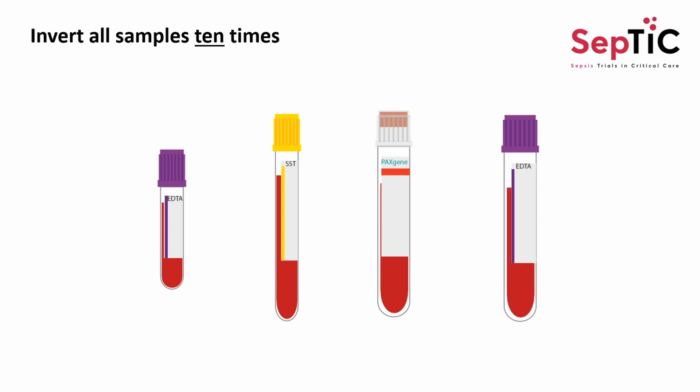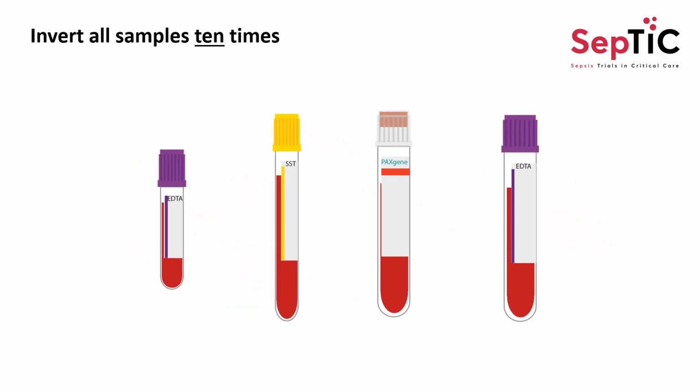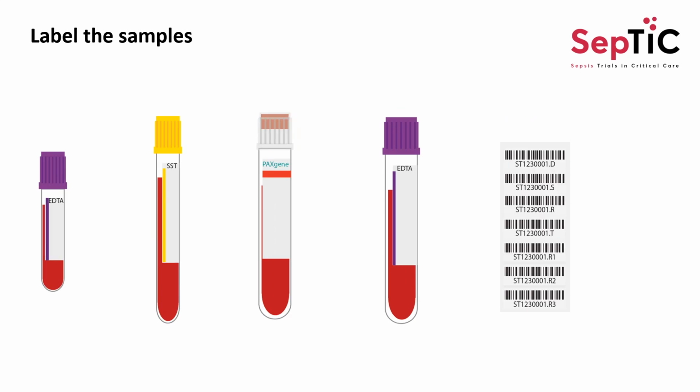Once your tubes have been filled, it's important that they are all completely filled. They need to be inverted. This should be done 10 times per tube. Once the tubes are full and have been mixed, it's time to put on the labels.